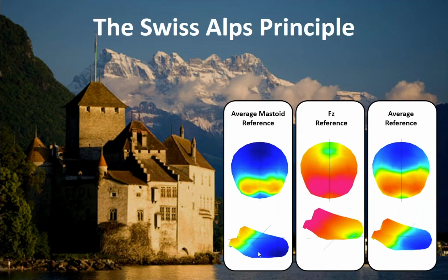And since we know that changes of topography equal a change in the network, being able to detect topographic changes is therefore directly neurophysiologically interpretable and quite informative about the processes that might be underlying our experiment. Okay, so this is all theory right now. But how do we quantify this? How do we do this in a headache-free way to quantify our data, take advantage of high-density EEG, and have a stronger and more data-driven and therefore less biased interpretation of our data?